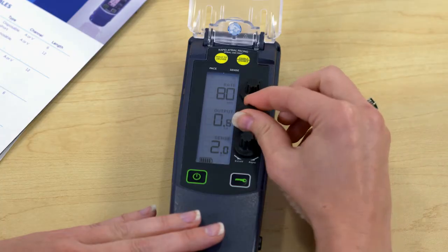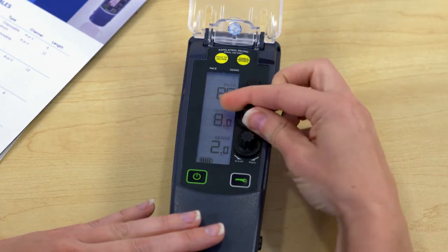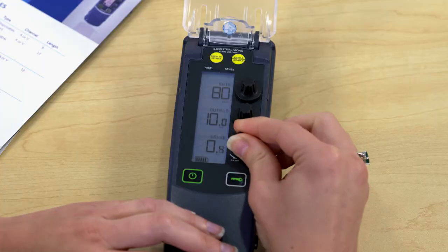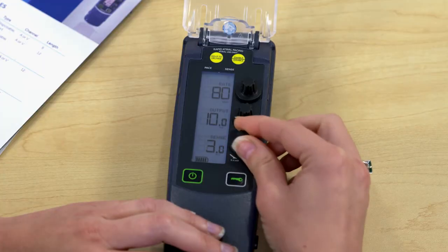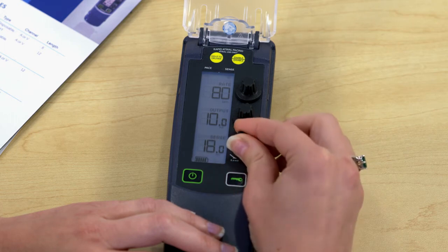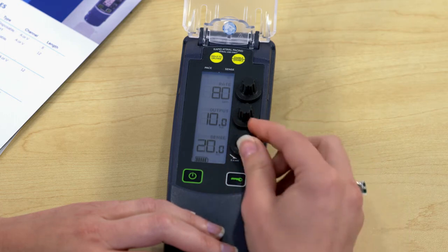What is the range of output values? It can go as low as 0.1 milliamp all the way to 25 milliamps, so it's sure to meet all your patient needs. The sensitivity range is 0.4 millivolts to 20 millivolts. There is also the option for asynchronous pacing.